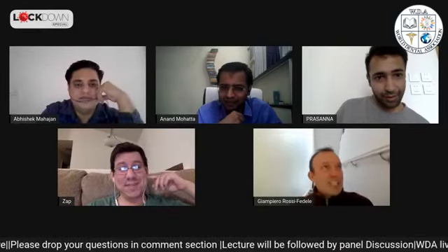Yep. All right. So can we agree that all three of us consider ultrasonic to be a better strategy than sonic? It depends. I agree with that. Can I just say that doing every step right is the best strategy. That is from the rubber dam, from caries removal to diagnosis to after treatment restoration.